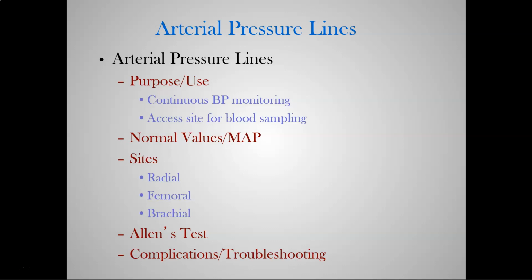Femoral, we don't check. It's a larger vessel. You do not need to check blood flow unless there are obvious signs of malformation or something else going on down the femoral region. I'm not going to check for peripheral blood flow there or for brachial blood flow.